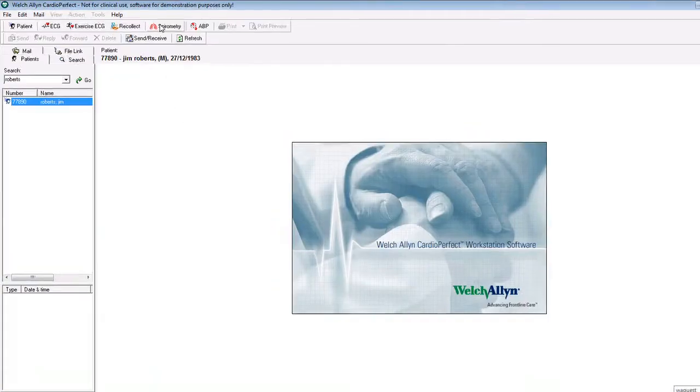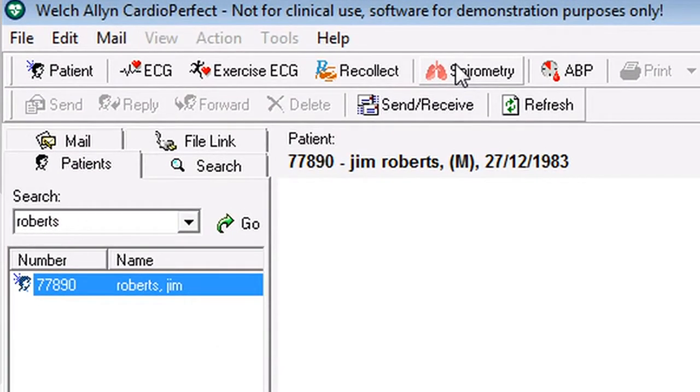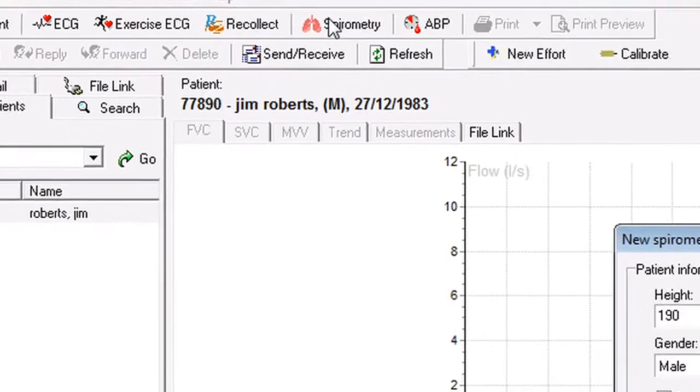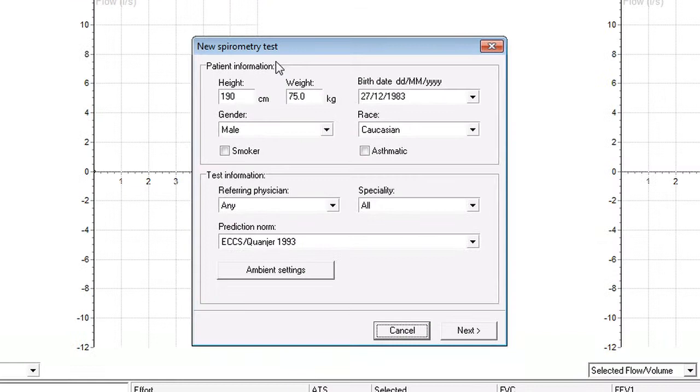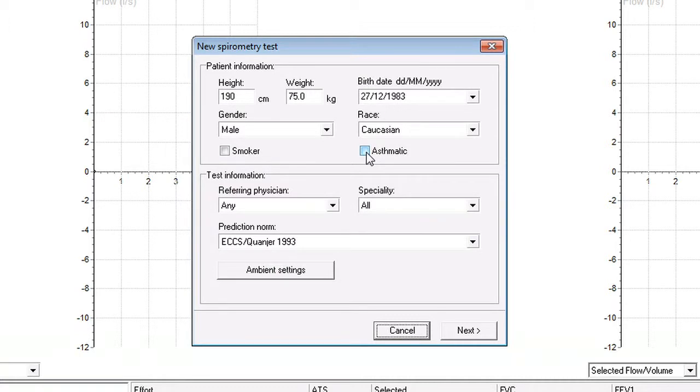Go up to where it says spirometry at the top of the screen and click on the icon. It loads the module and a box headed new spirometry test appears on the screen with all the details of your patient. Now if they're a smoker or an asthmatic, you can note it at this point. Then click on next.